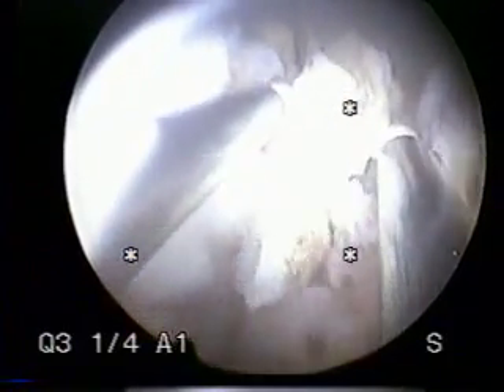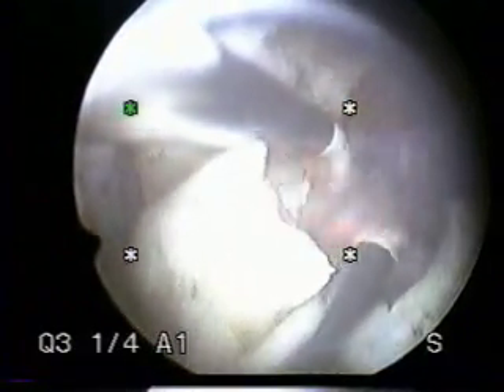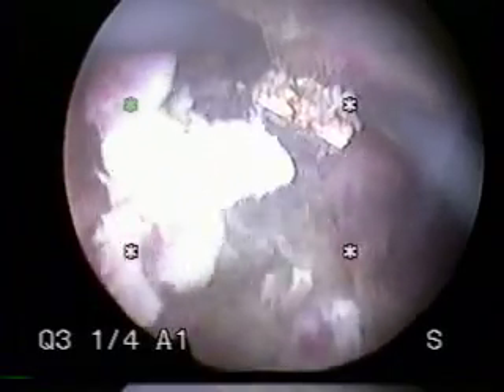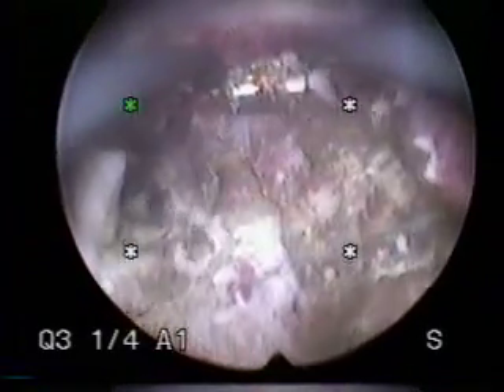You still see the fibroid that is sitting just underneath the surface of the endometrium. At this point, most of the fibroid has been removed, and I proceed with a Gynecare Versapoint bipolar cautery instrument to finish the cauterization.